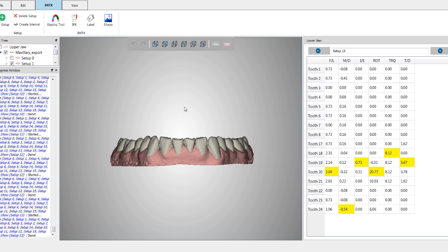The first one is, if I am going to extrude a tooth, I always place attachments. If I have a very large rotation, I always place attachments.